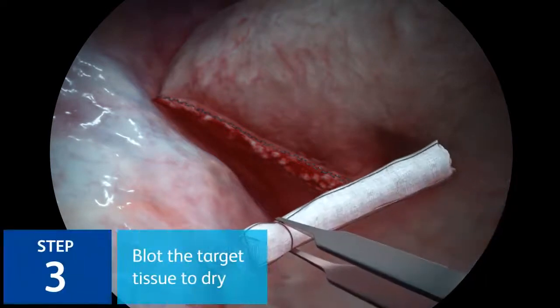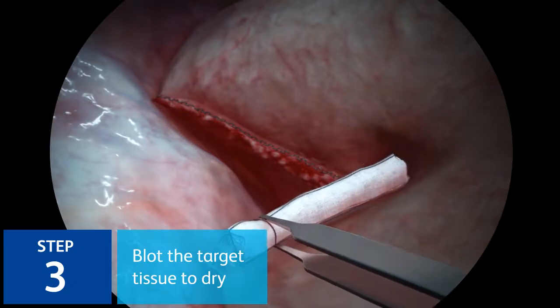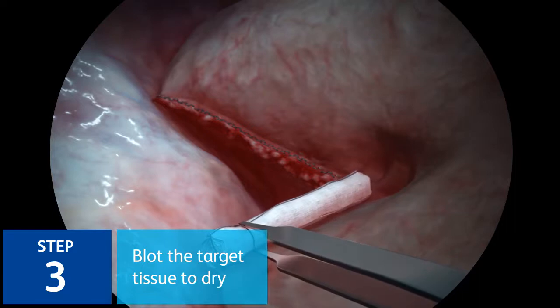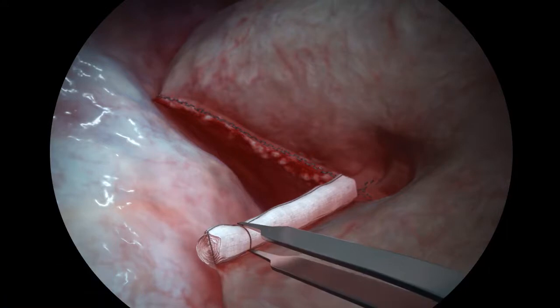Step 3. Blot the target tissue area with a sponge or gauze to remove any excess moisture. For best results, Progel Pleural Air Leak Sealant should be applied to a clean, dry surface.